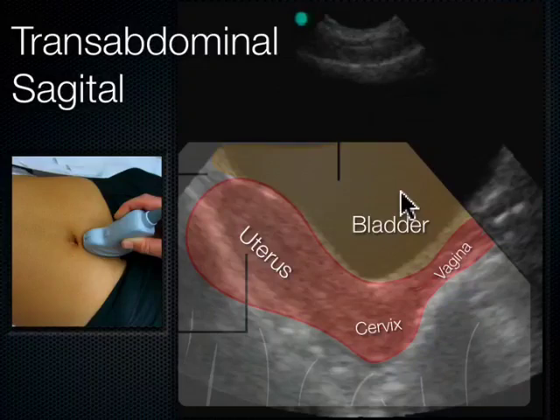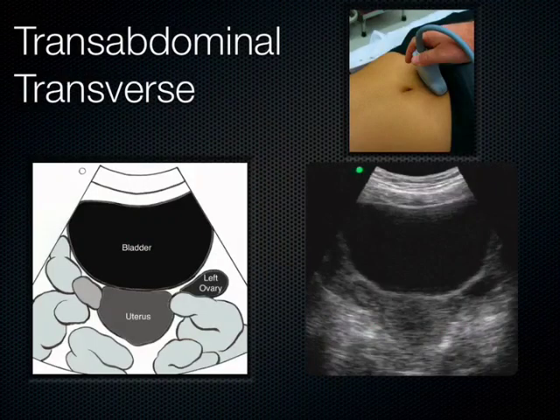All the way back, like 160 degrees, almost 180 degrees back towards the vagina. Okay, so that's what happens when you have an empty bladder. When you get a full bladder, you get a much better view, using the bladder as your acoustic window. When we move the probe into a transverse plane with a full bladder, we now see this rectangular shaped bladder instead of triangular shaped.